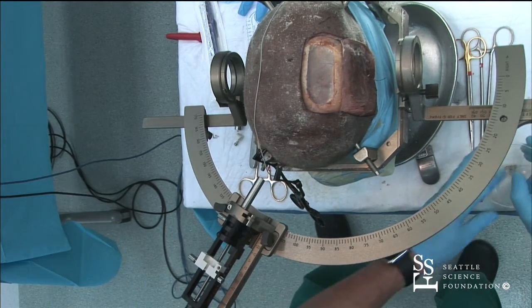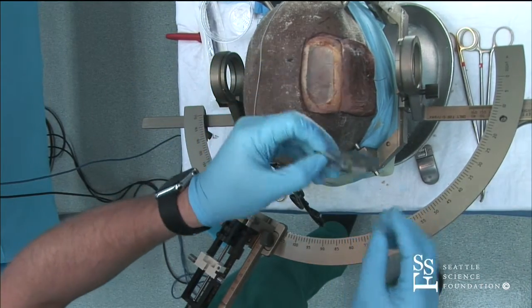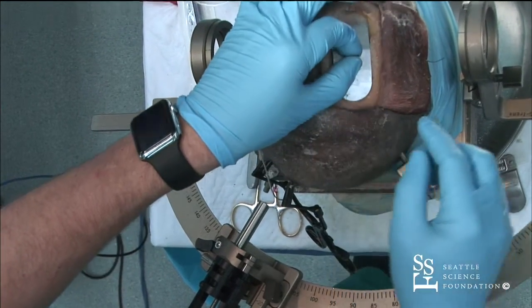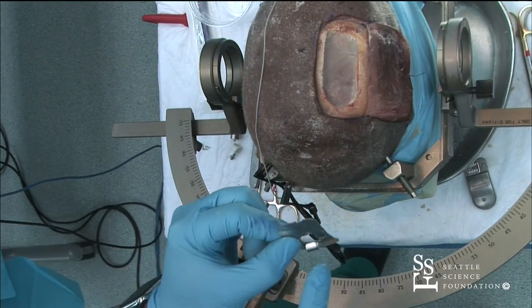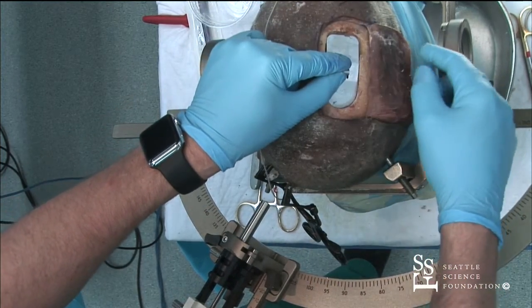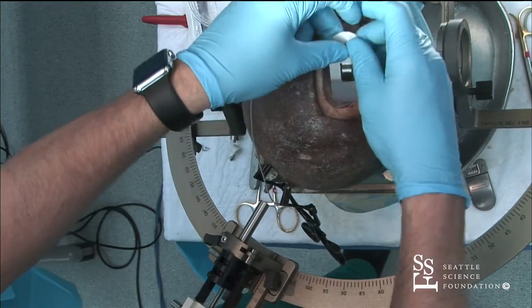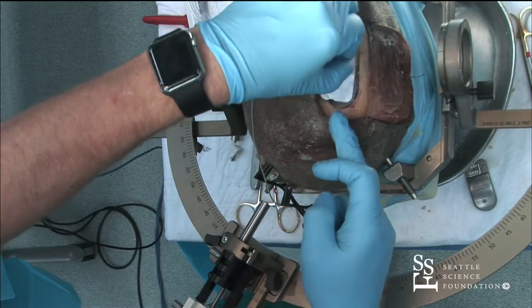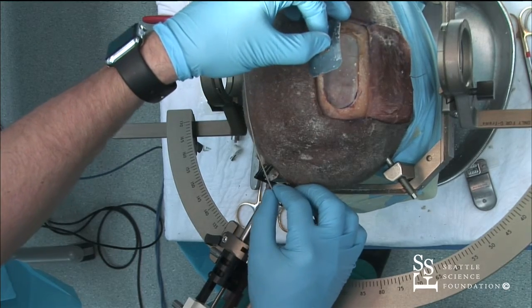Here it is. So when you're designing where to make the incision, I'll typically take this template, put it on the scalp and see where it fits the best. And then you have to be careful because the electrodes will always come off of this side of the template. So I try to design my skin incision so that the electrodes come off underneath the flap. If I put it this way, the electrodes would be going underneath one of my incisions. So if I wanted to come back later, I'd be putting those electrodes more at risk. These are not well protected electrodes.